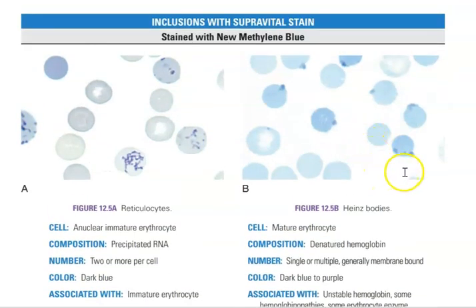You're looking at Heinz bodies. Now Heinz bodies look very similar to Howell-Jolly bodies, but Howell-Jolly bodies are inside the red blood cells, whereas Heinz bodies are kind of hanging off the edge. So make sure you make that distinction. See, all these are hanging off the very edge of the red blood cell.